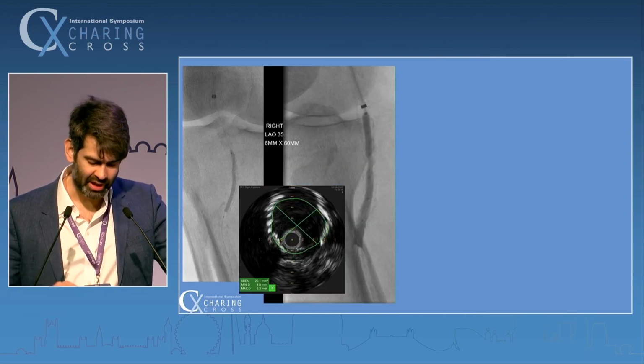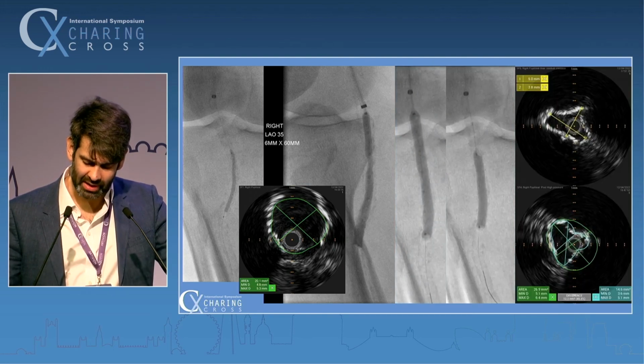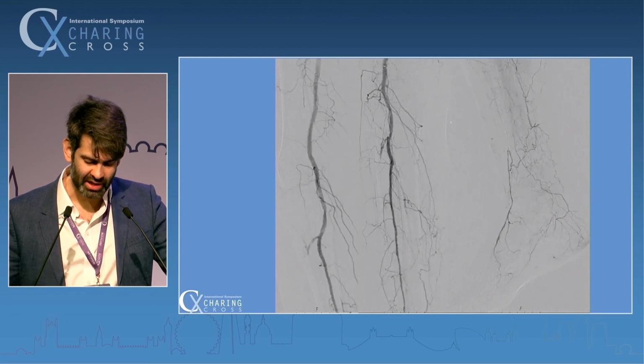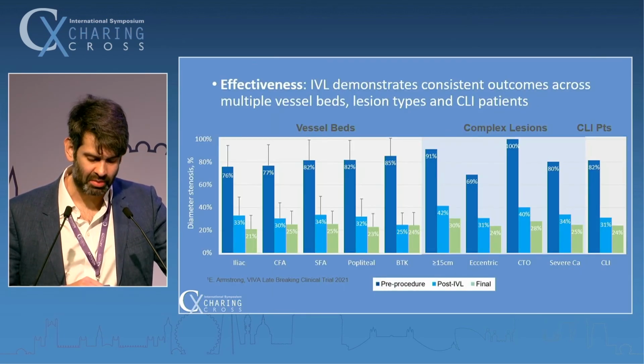I have to do a little bit of pre-dilatation to get the Shockwave balloon through, but you can see this very, very pleasing result with the intravascular ultrasound and excellent flow on the final angiogram, again, without having to stent, without having to cause a problem to the runoff.